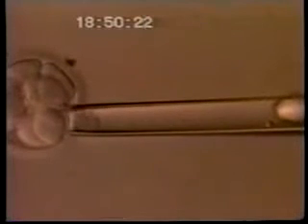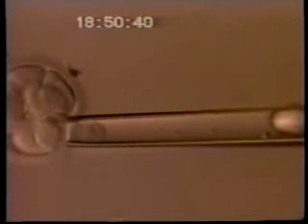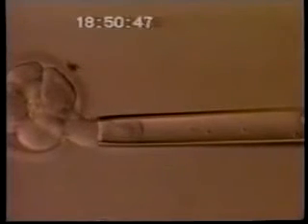Now that sounds a little bit easier than it really is in practice, because you'll see that each of these 8 cells is fairly tightly connected to each of the other ones, and it requires extremely gentle, delicate micromanipulation at 400x magnification with these little pipettes that are invisible to the naked eye in order to gently tease one of these cells out of the embryo without damaging either it or any of the other 7 cells. You'll notice that all the motions are extremely delicate and very slow under 400x microscopic magnification. You can see this cell has been beautifully pulled out of the embryo now, intact, so that it can be genetically tested. And the embryo has not suffered any damage in the process.